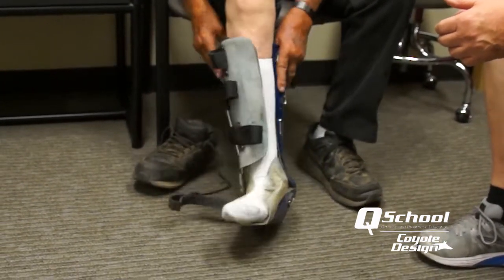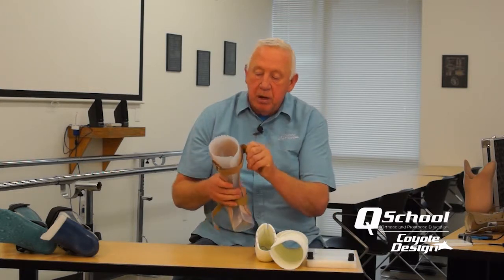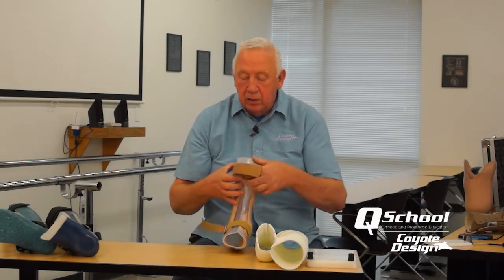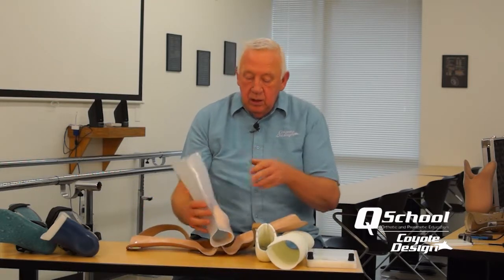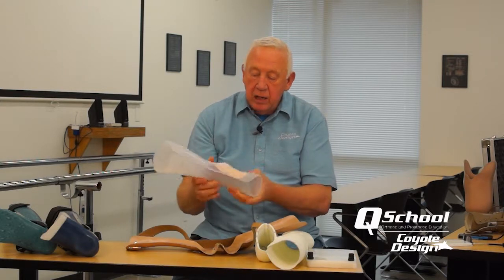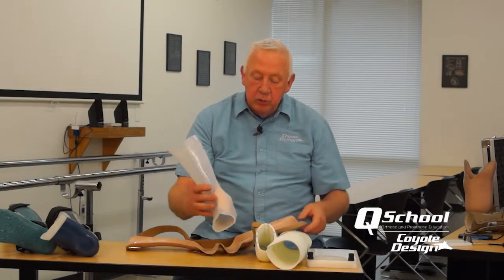We have several different designs in this course. One is our bivalve design, which is a composite and thermoplastic combination — just a solid ankle AFO system. This uses a bio-elastic material for the inner socket for patients who require really good ankle immobilization.